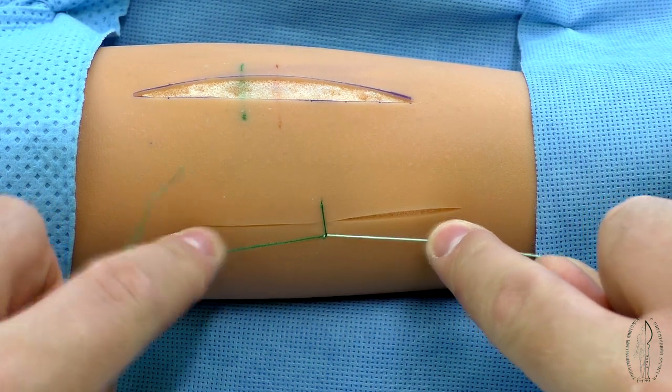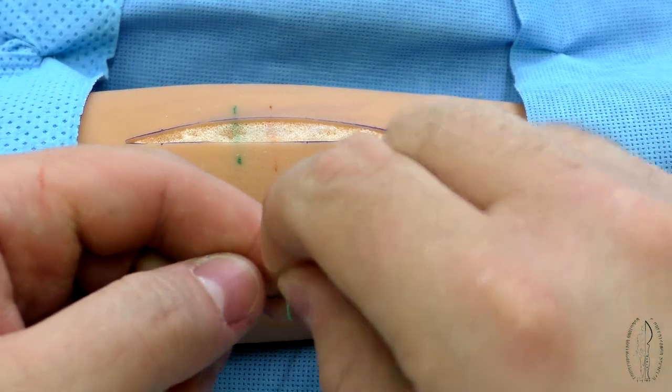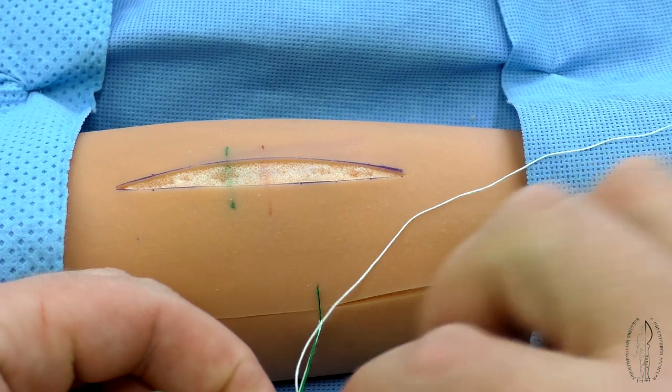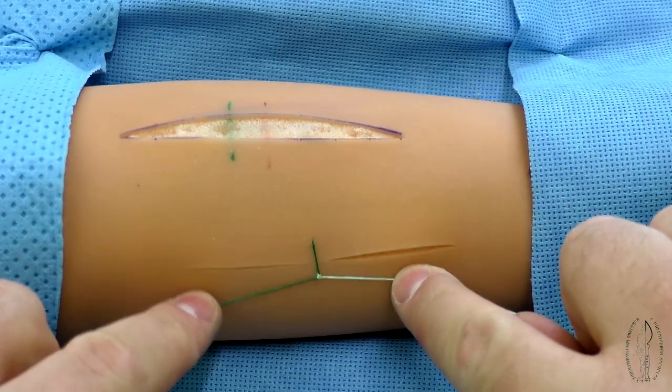Further, the loop is tightened. Tightening degree is performed by the big or index fingers with equal effort and depends on the risk of sewed tissue cutting and a possible sewed rupture.